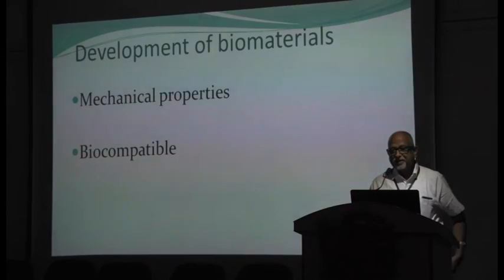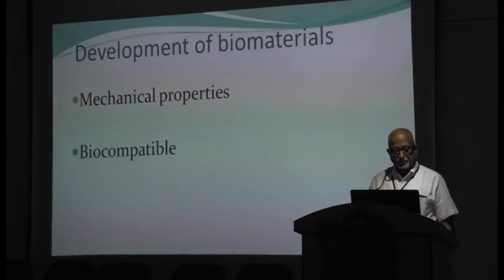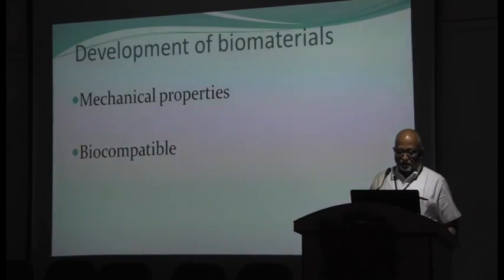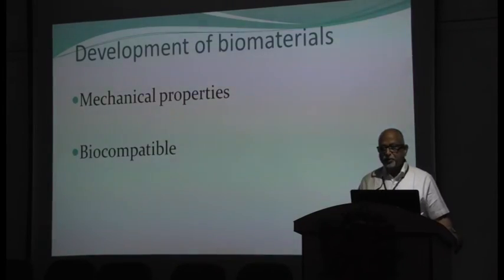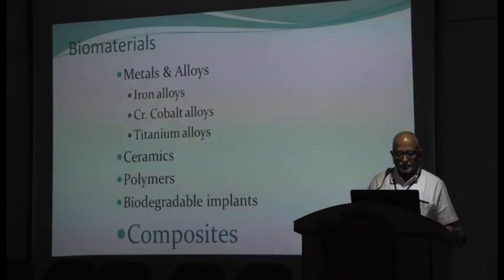The next issue we need to address is the material that we are using. Can we improve upon what material we are using? This again was a part of a small research project which I got involved in with a material scientist at the Indian Institute of Science. The material was expected to be biocompatible as well as have the mechanical properties which suit our need.